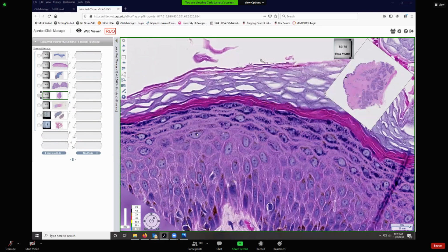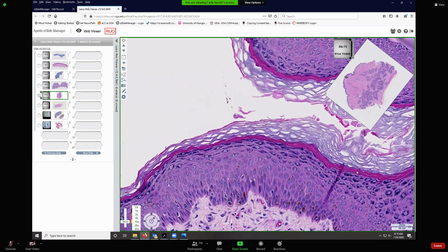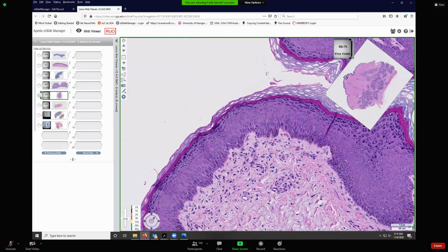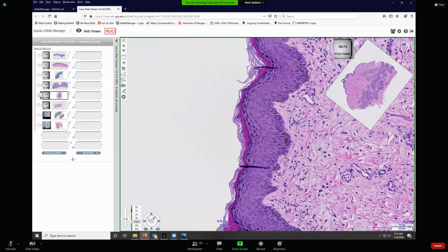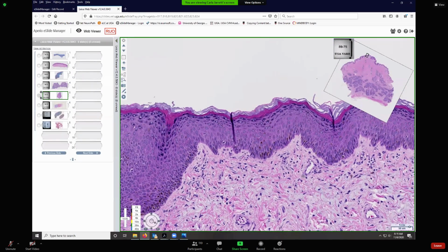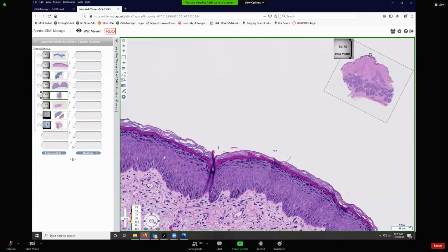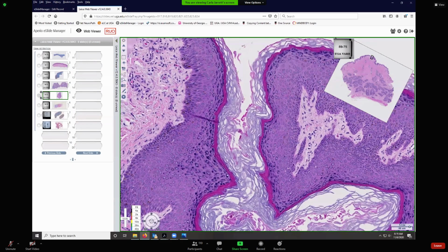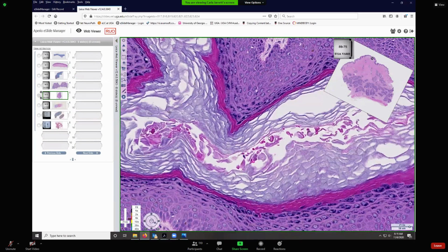You should be fairly familiar with that. You'll have the stratum corneum right here, this acidophilic layer of dead cells that have gotten rid of their organelles and nuclei. But then you'll have all of this that's lifting off, wanting to peel off right here. And an extra term, because you can never have too many terms in histology: for that lifting off, starting to slough layer, the stratum disjunctum. It's become disjoined from the rest of the underlying stratum corneum. So this would all be stratum disjunctum right here, where it's lifting off.